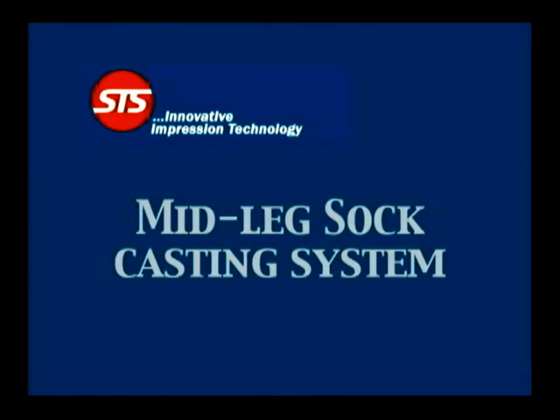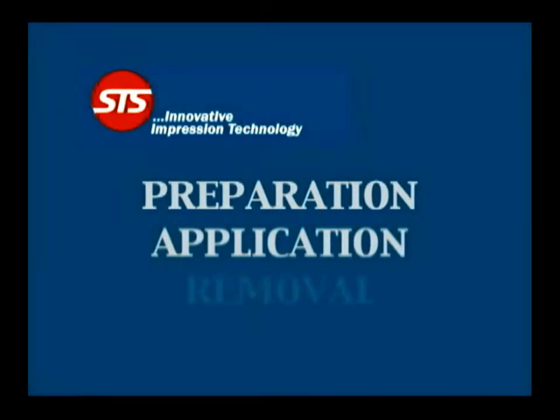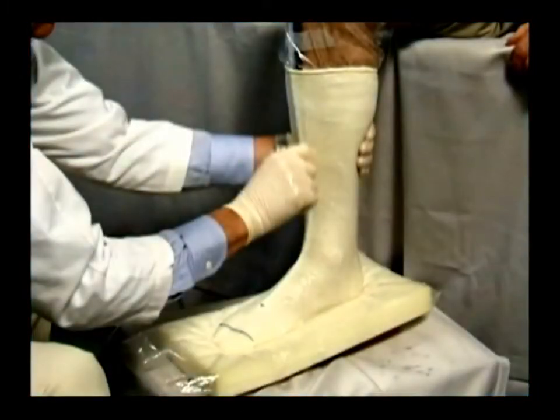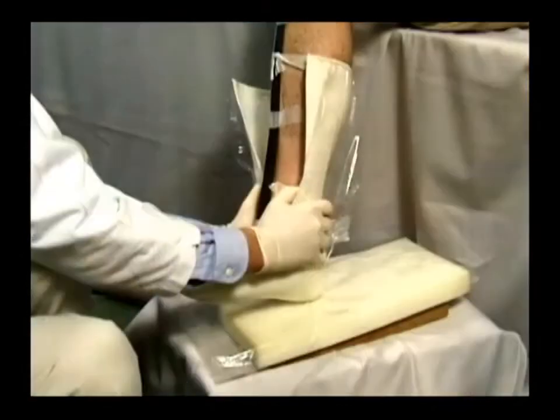The STS casting system consists of three parts: preparation, application, and removal. Each part has specific steps that must be followed in the exact sequence shown in the video. Once you have mastered the basic technique and are intimately familiar with the application process and properties of the material, slight variations of the process may be made to suit your needs.